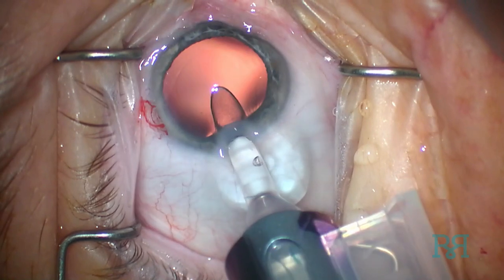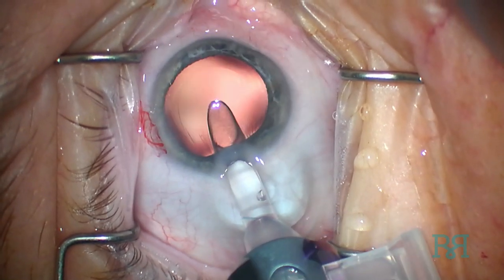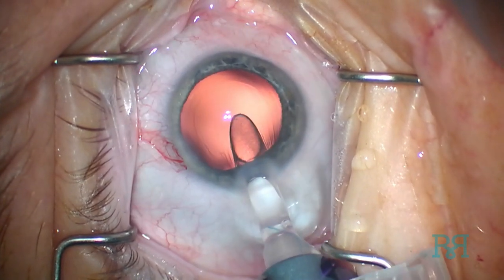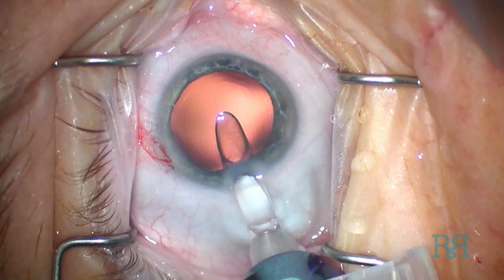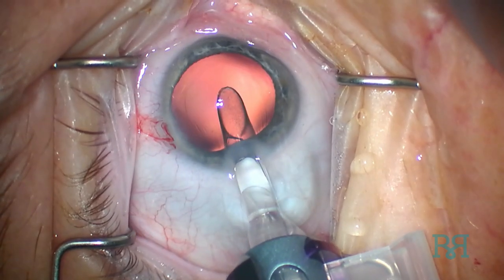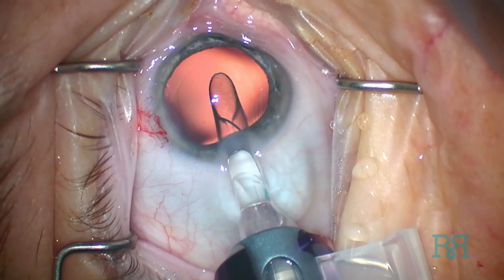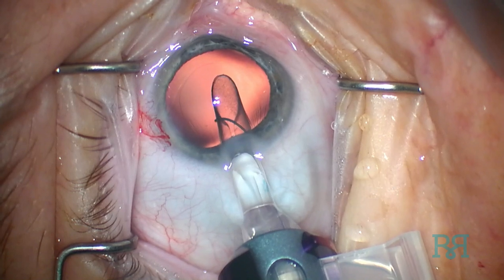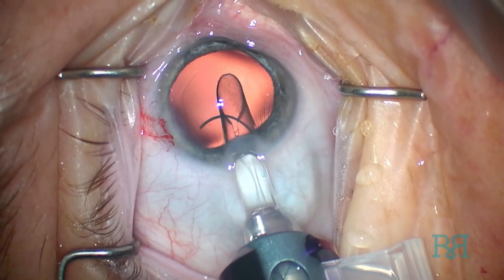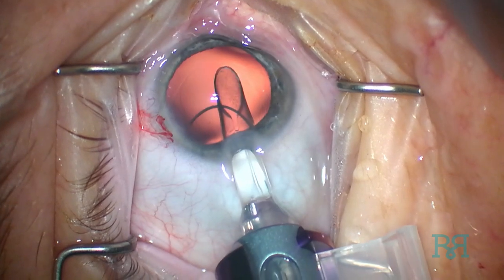The inserter is placed such that the opening is in the anterior aspect of the capsular bag. The knob is rotated clockwise and the leading haptic catches in the notch at the posterior aspect of the inserter. It is oriented such that it is in a horizontal plane, in this case moving to the left.